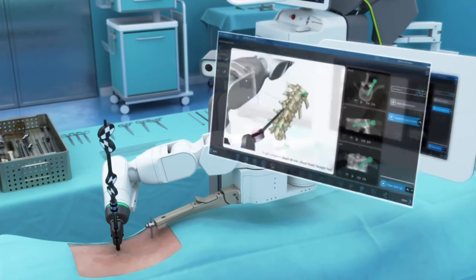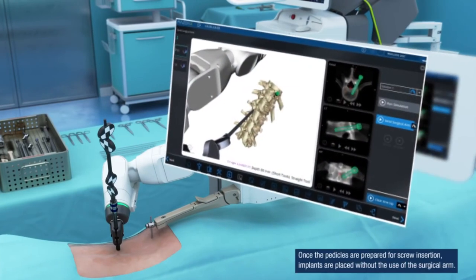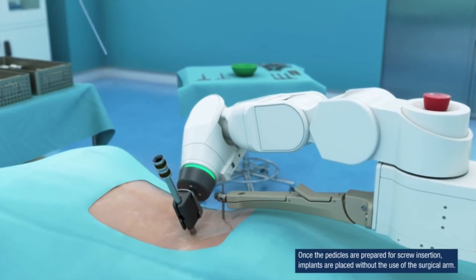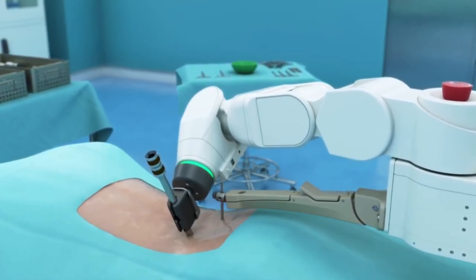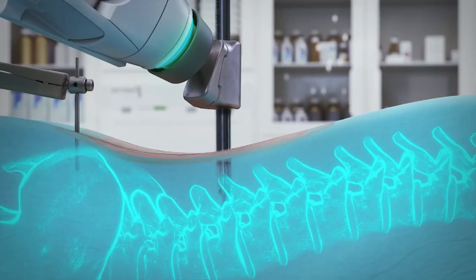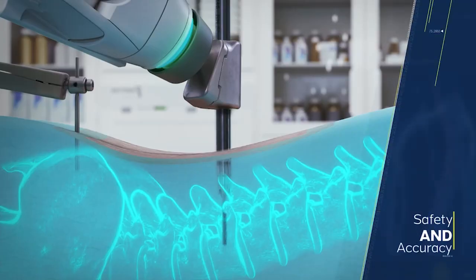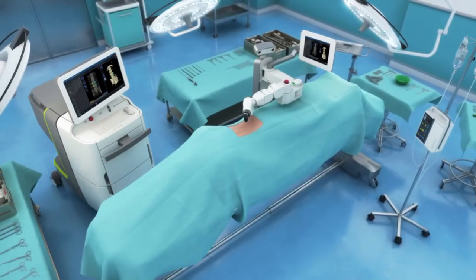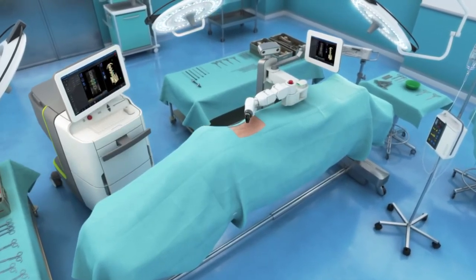Once verification is complete, the surgical arm and drill guide keep tools and implants on target for each trajectory. This process continues until all trajectories have been reached and implants are inserted safely and accurately into their planned position. Mazor X: the core of the surgical assurance platform.